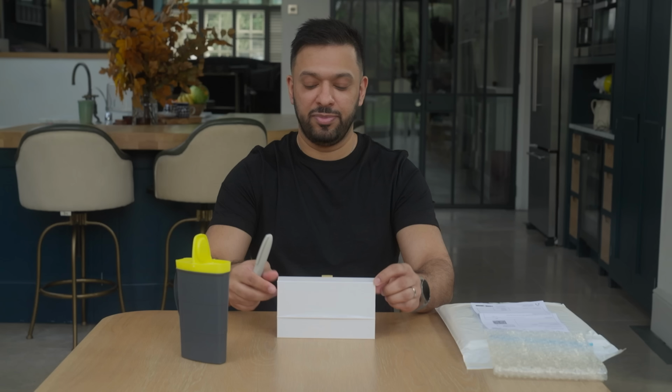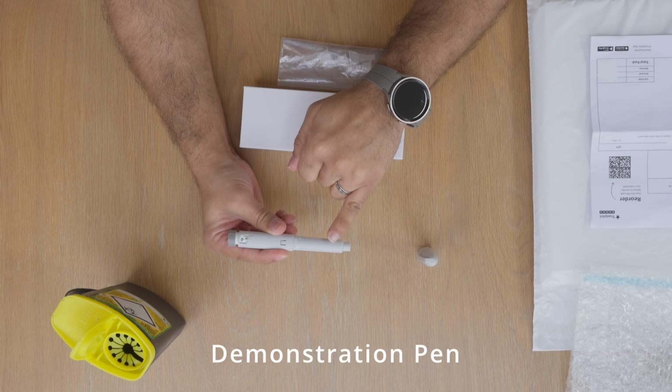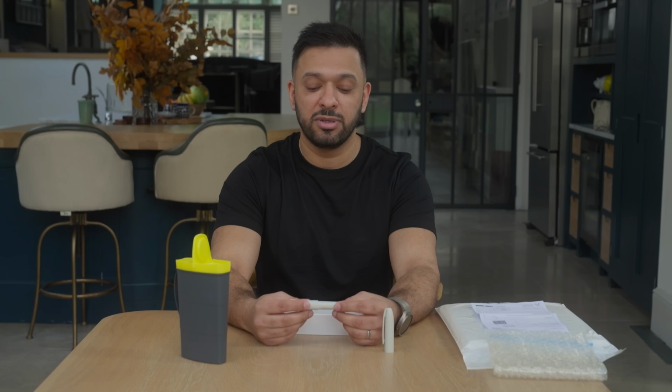Your device will look very similar to this demo pen. When you remove the cap, your device will have a clear window displaying the liquid. Before you get started, check that this liquid is clear and it's not cloudy, frosty or contains any particles. If it does, please do not use the pen.